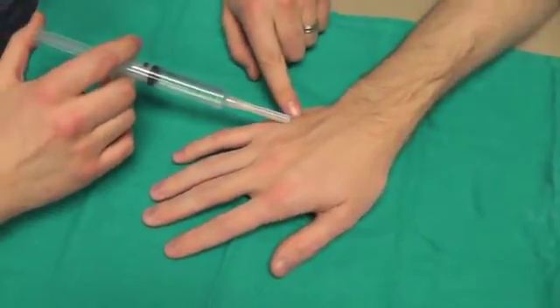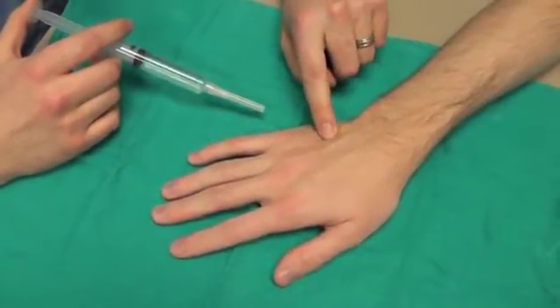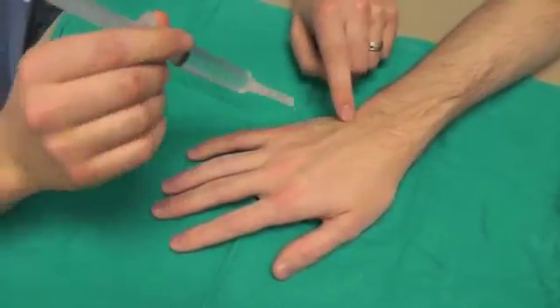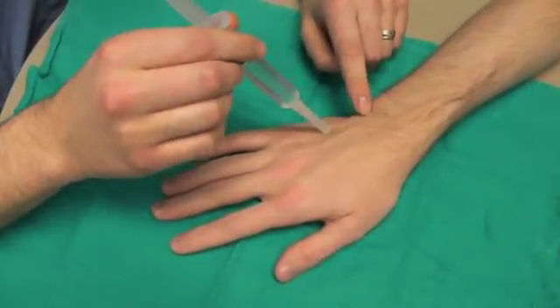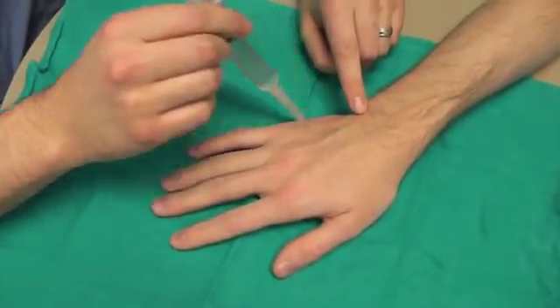Landmarks here are along the metacarpal on the dorsal aspect. You can palpate the base of the metacarpal, and we're going just distal to the base. Entering directly above the metacarpal and then passing our needle on either side — both the radial and ulnar side.